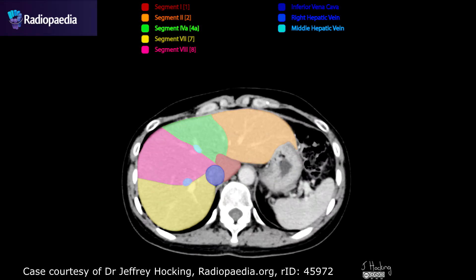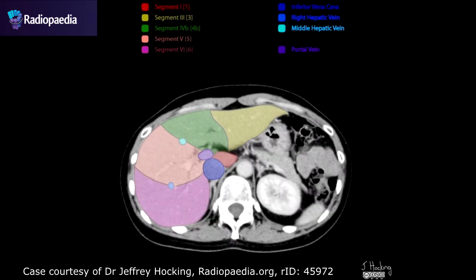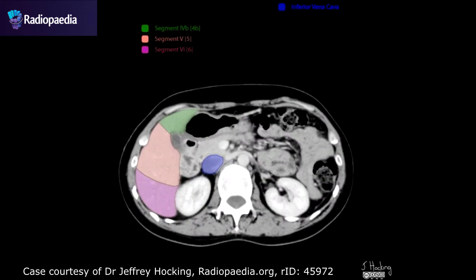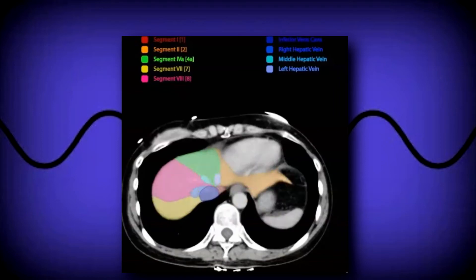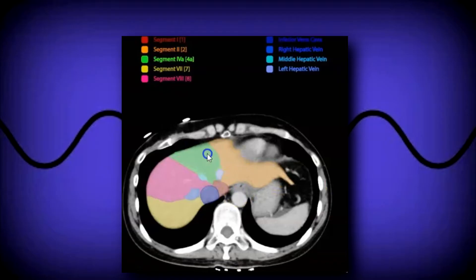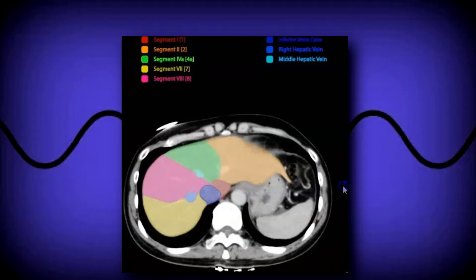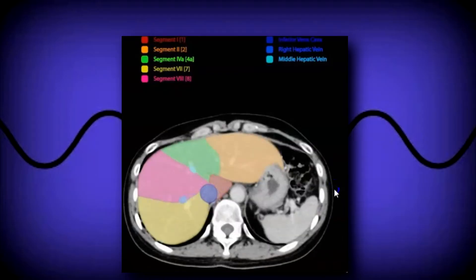Now we'll look at the great diagram from Radiopaedia, made by Dr. Jeffrey Hocking. From superior to inferior on CT, at the top you have segment 4a, segment 8, a little bit of segment 7, and a little bit of segment 2. As you go down you still see segments 2, 4a, 8, and 7. Further down you can start seeing the hepatic veins dividing everything laterally.